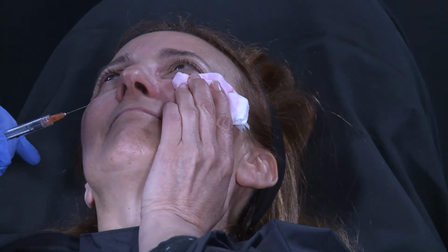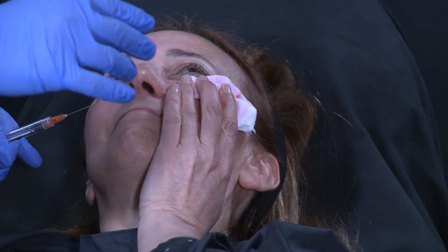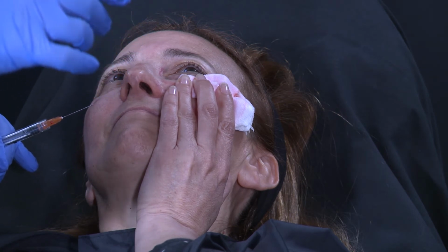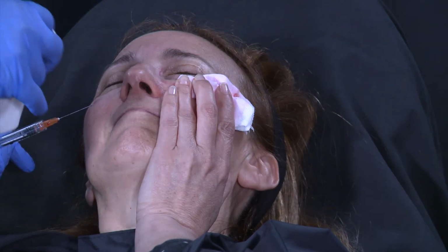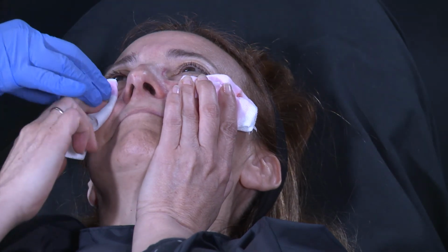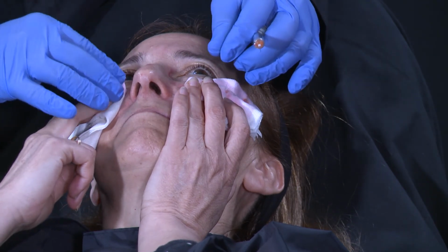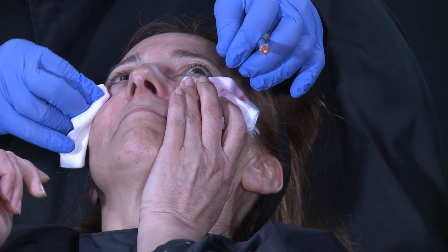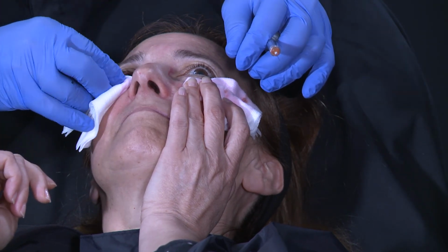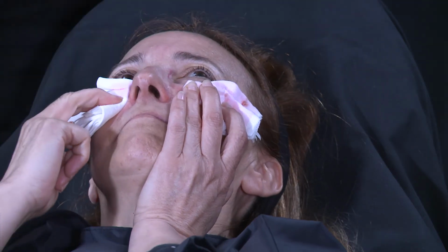Okay, I will take a little dressing, like this. Yes? It's okay. Thank you. Thank you very much. Okay? So they press a little bit on the entrance point, but they don't press on the... And look, she has no more. Yes, yes, we will do it.